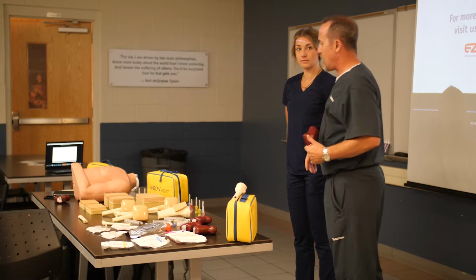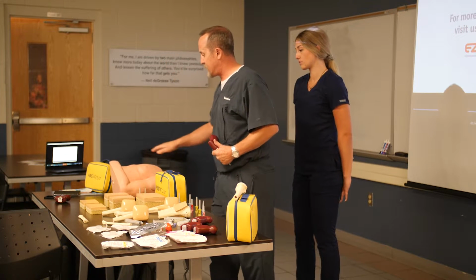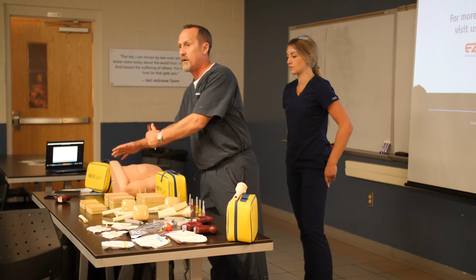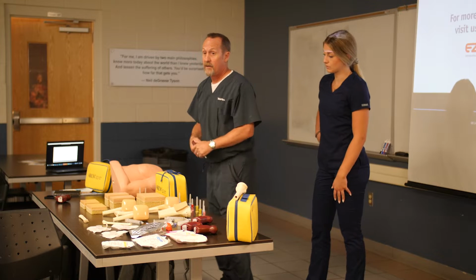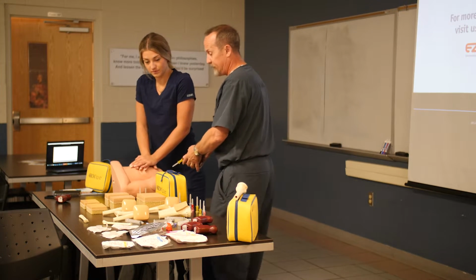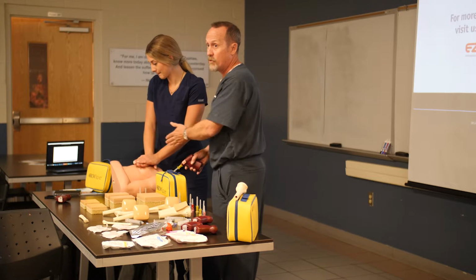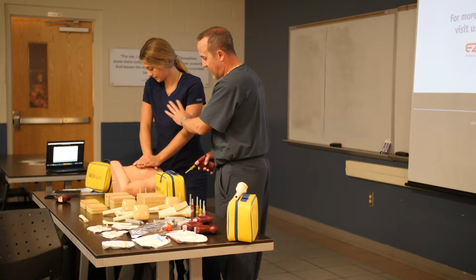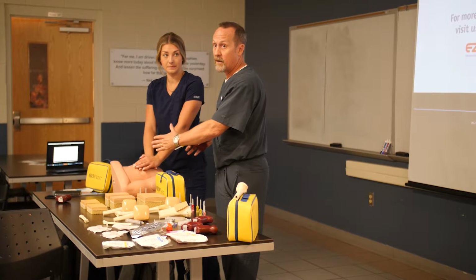Now, just to show you guys what that means: if we're in a code case and you've got somebody over here doing compressions or hooking up a Lucas or whatever, and somebody up here managing airway, what we can do is approach the patient at a 45-degree angle. We've already established our line of trajectory, so we know we're in the right spot, but I'm kind of in no man's land right here. There's nobody here, and I'm not gonna interrupt anybody that's working on that patient.